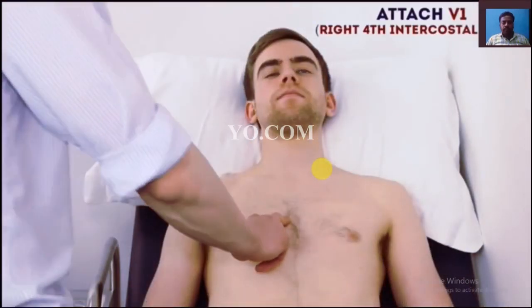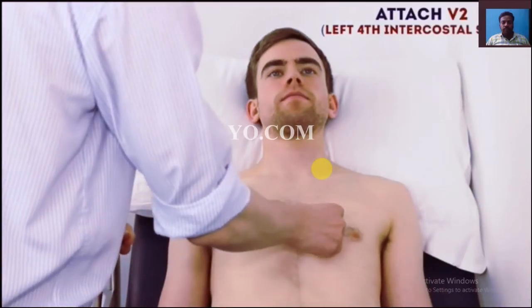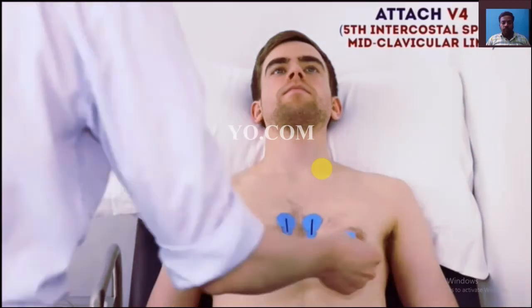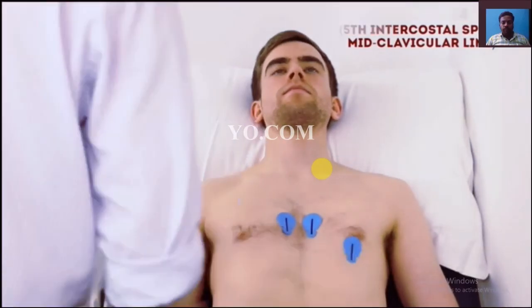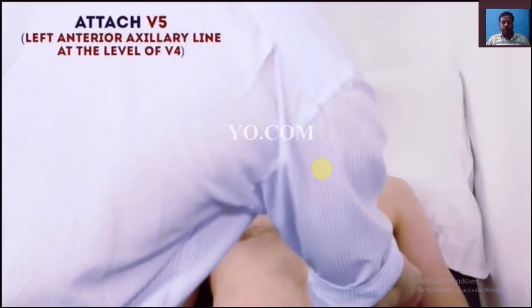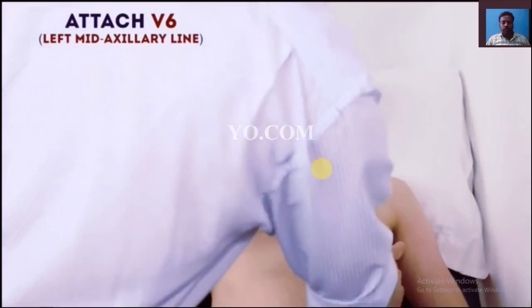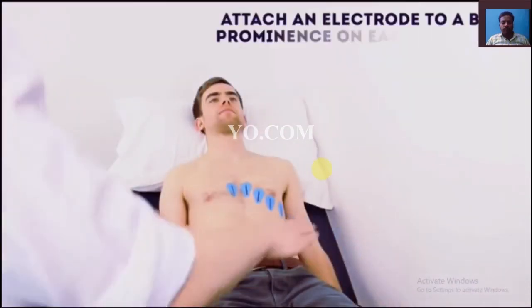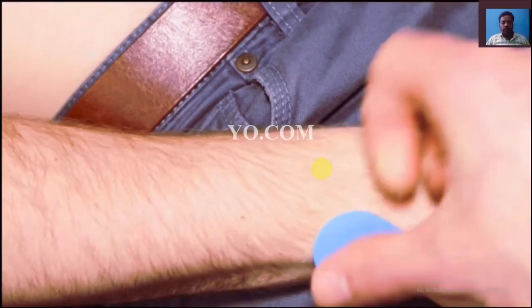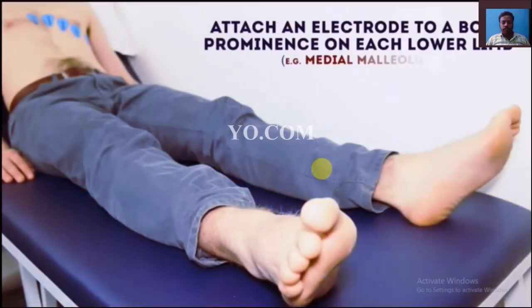Just going to place some sticky pads on. So if you just relax your hands flat for me, just on the side. That's great, thank you. Just going to put some sticky pads on your wrist. And on your ankles as well.